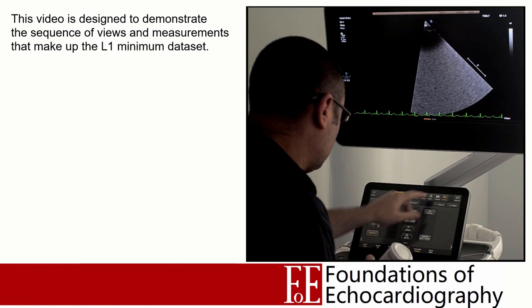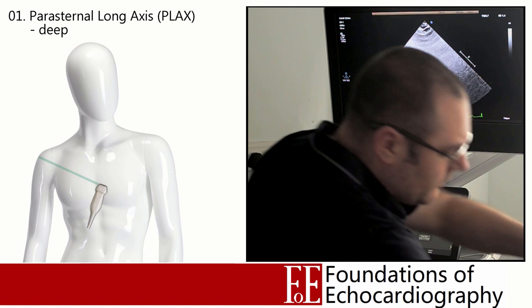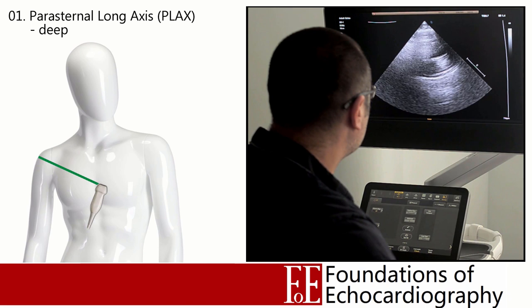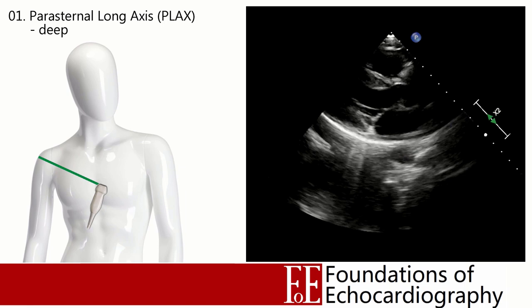Now that we've been introduced to our phased array probe and know how to manipulate it, let's start performing our first scan. I'm going to walk you through the BSE's minimum data set for a Level 1 scan, which has 18 key views and measurements. Start by applying a three-lead ECG to the patient and getting them in the optimal position — ideally lying in the left lateral. We're going to start with the parasternal long axis view, placing the probe around the third or fourth intercostal space just left of the sternum, with the orientation marker pointing towards the patient's right shoulder.